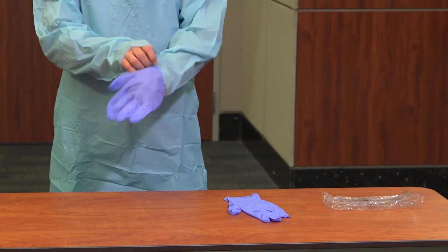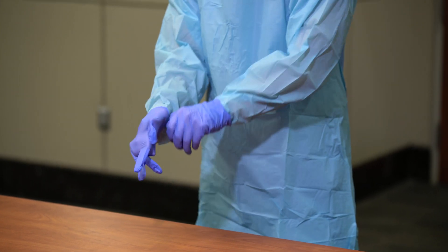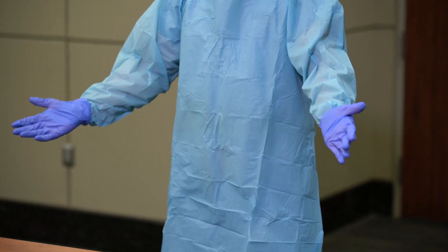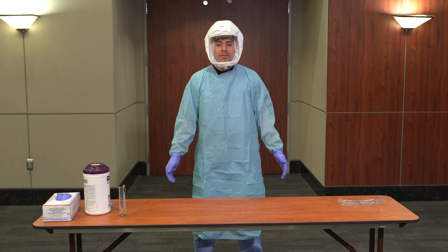Don gloves. Gloves should not be too tight or too loose — tight gloves could potentially tear, and loose gloves will hinder your ability to perform certain patient care tasks and may come loose. Ensure the gloves are worn over the thumb loops of the isolation gown. You may now enter the patient's room. Transmission-based precautions must be applied in conjunction with standard precautions.